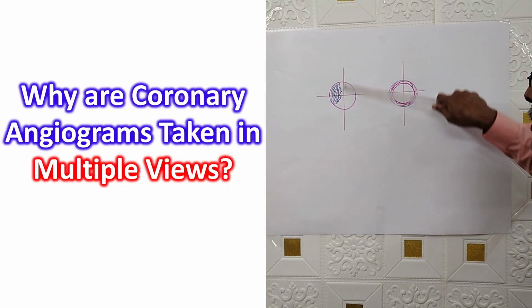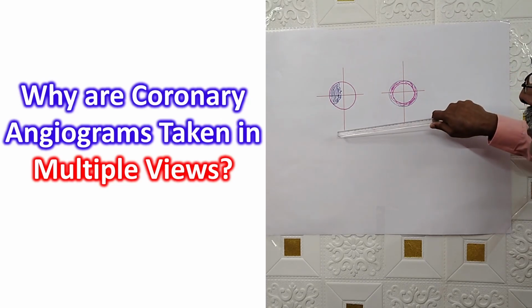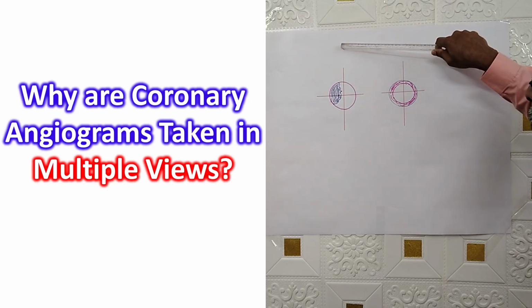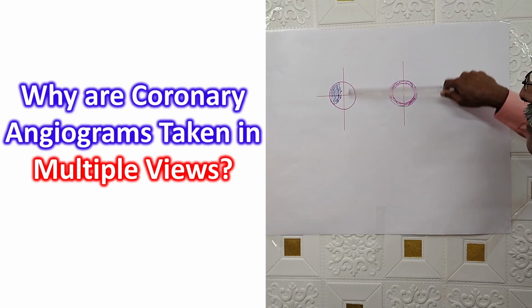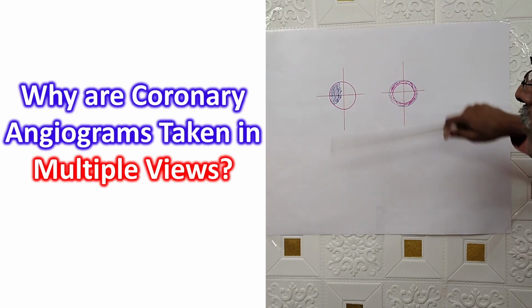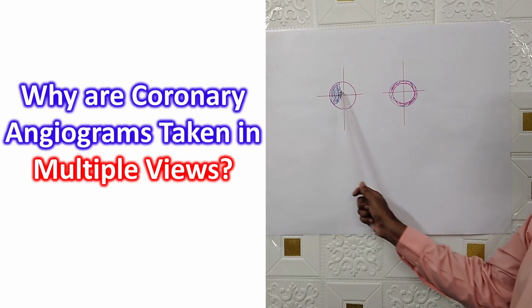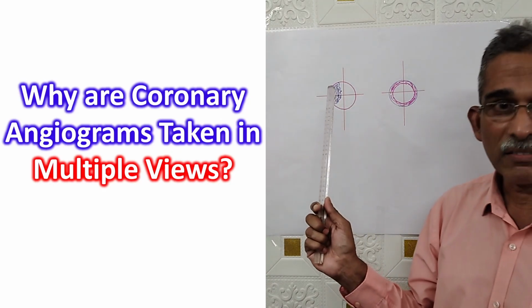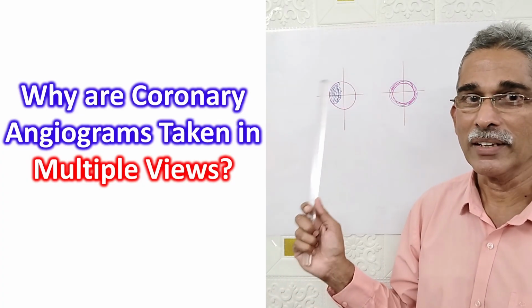Suppose you image in this plane, X-ray beams passing from here to the X-ray source is here and the image intensifier is here. If this is passing this way, this may not be imaged at all because it is passing through a region where there is no lesion. On the other hand, if you image in a perpendicular or orthogonal plane, you know that the lesion will be well delineated. That's one simple thing.